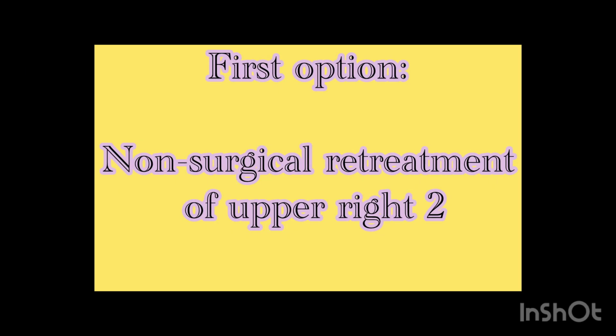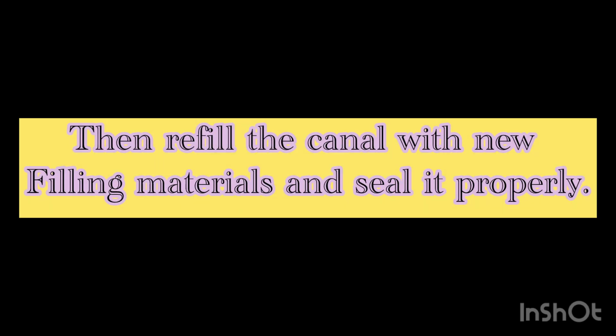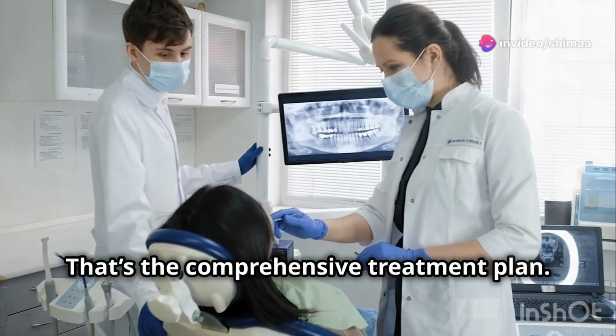First, we will perform a non-surgical retreatment of the root canal on the upper right lateral. This involves removing the old filling material, cleaning and disinfecting the canal. Next, we will refill the canal with new material and seal it properly. If the retreatment fails, we will consider surgical options. In extreme cases, extraction might be necessary. That's the comprehensive treatment plan.